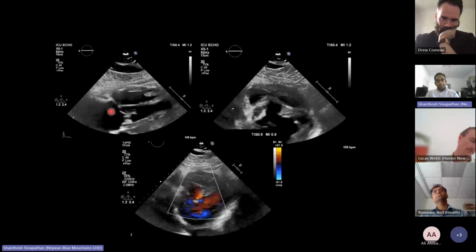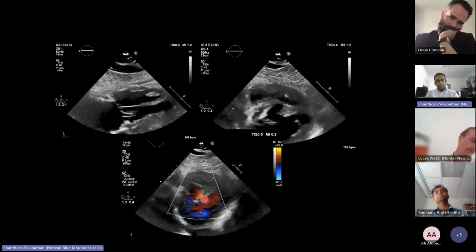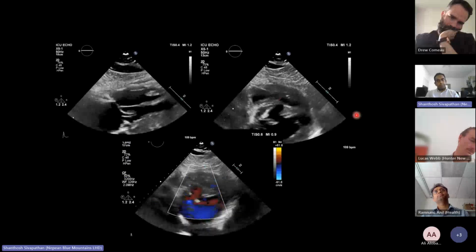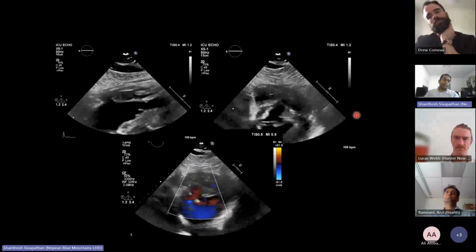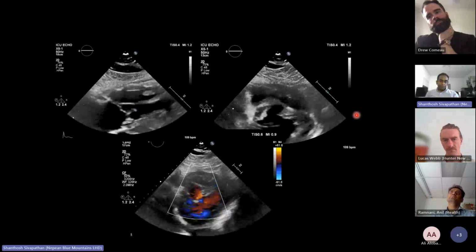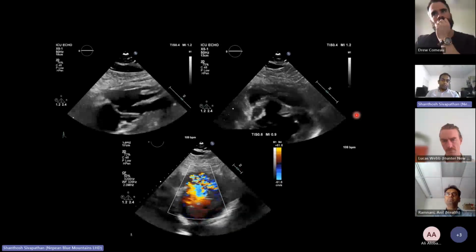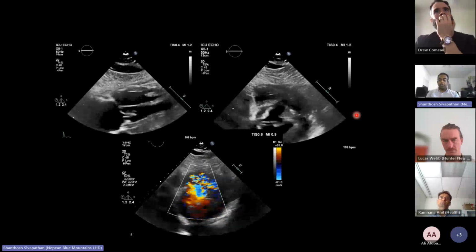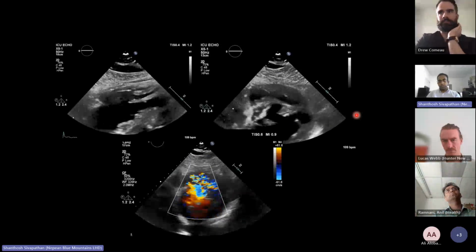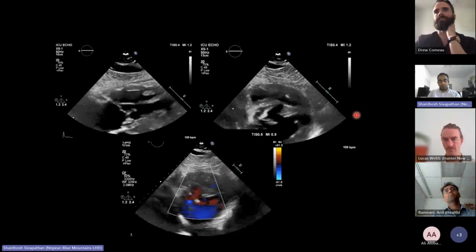They've gone back to the subcostal view. Looks like there is a VSD there. And they've put color across there, and that confirms it. So it's always important to see whether you can get the same sign or findings in different views. And obviously, sometimes you may have to go off axis to really grab the money shots, essentially. So don't always stick to your routine, but it's important to go fishing for it, essentially.